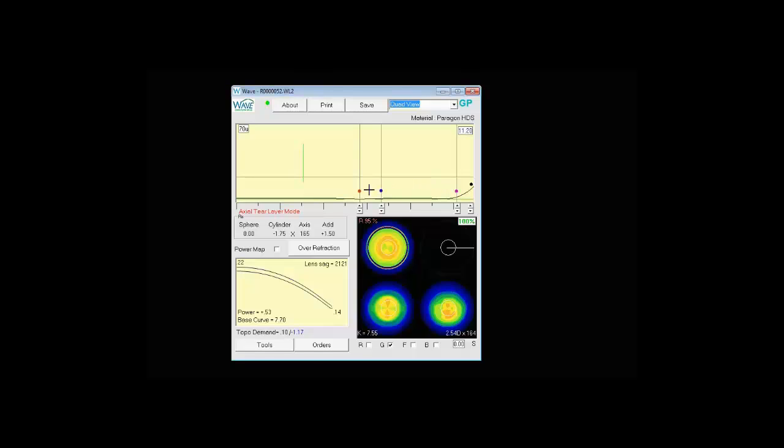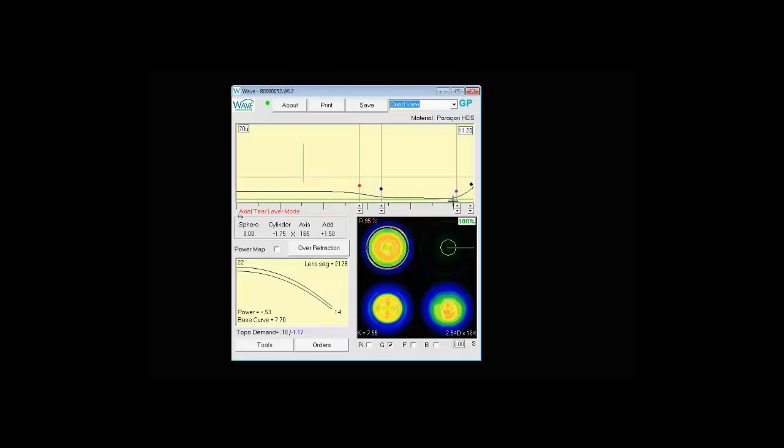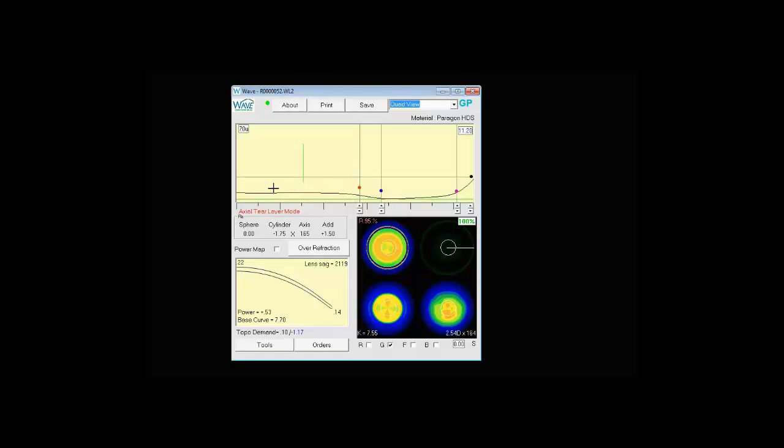If you prefer a different style of design you can alter that as you please. In this case if I click down a few times under the blue dot and up a few times at the pink dot, you'll notice now we end up with a little more central clearance, a little mid peripheral touch and a little higher edge lift. So based on your fitting philosophies you have the ability to design the lens as you like.